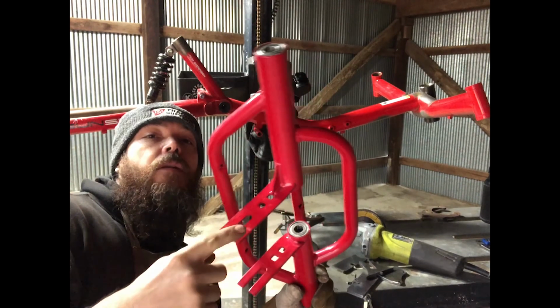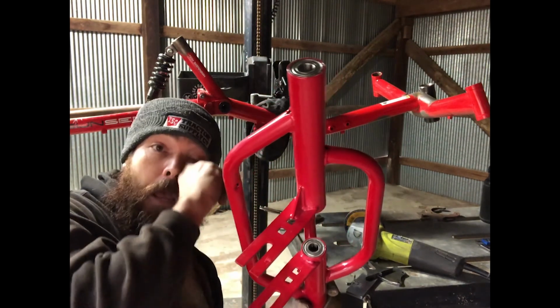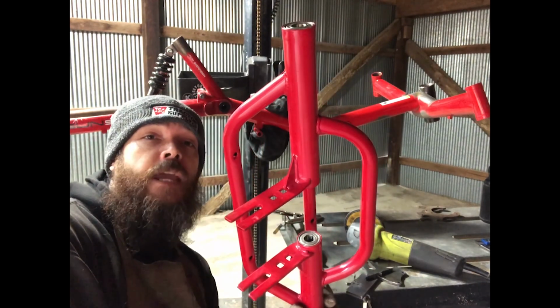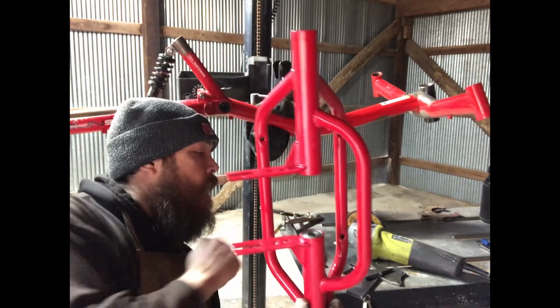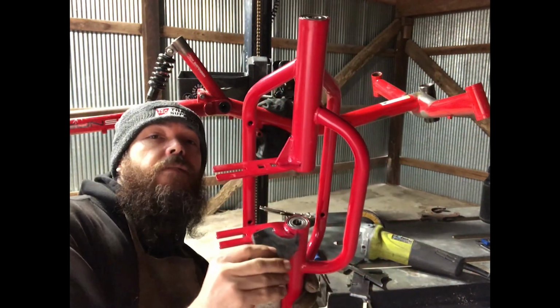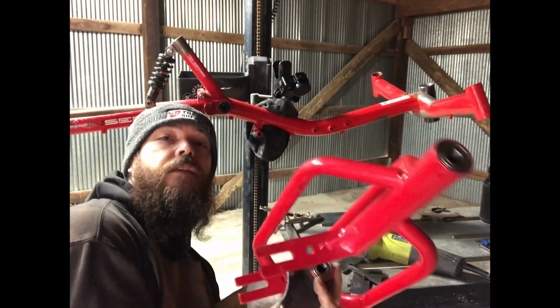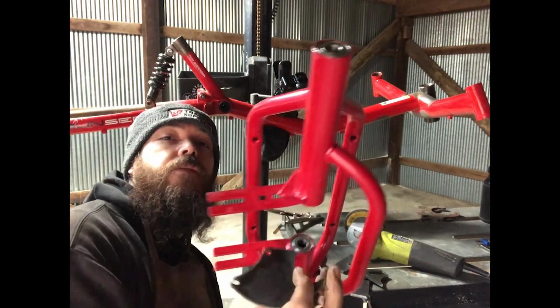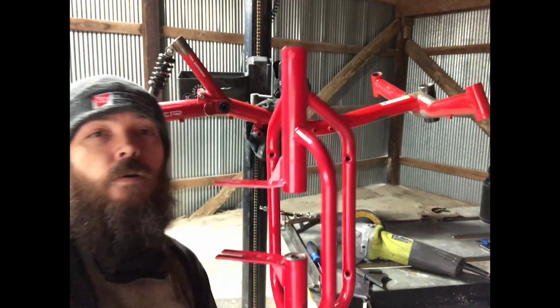Typically they bolt on with 2 points of contact, so you have one here, and then this is your adjustment for your chain. But we're going to go ahead and cut all this off and add a disc brake mount. So we've got a disc brake mount. That's going to go up kind of like so, which will give us a new disc brake mount capability, so we can add a rotor onto the back of here.